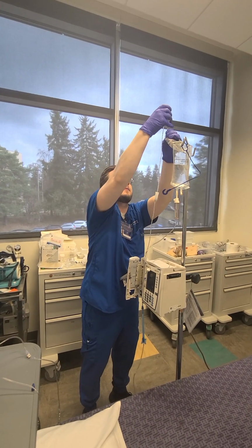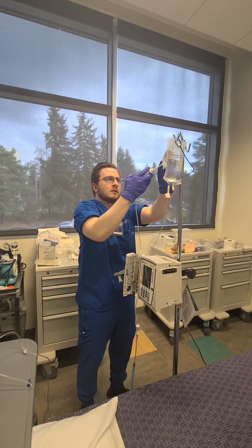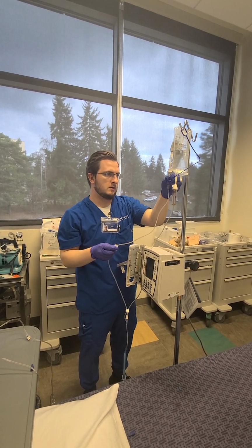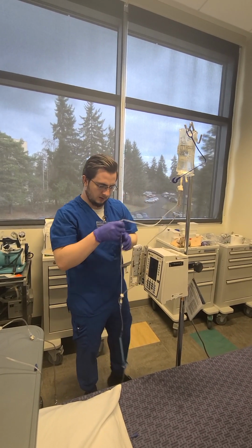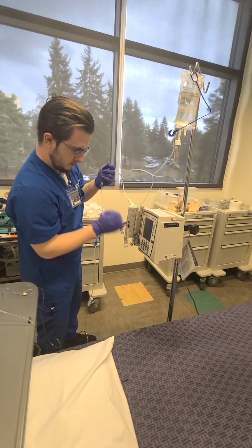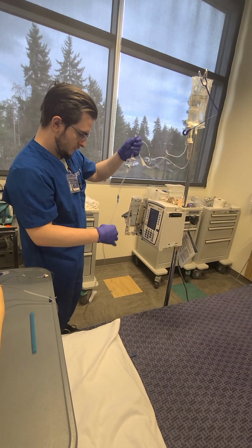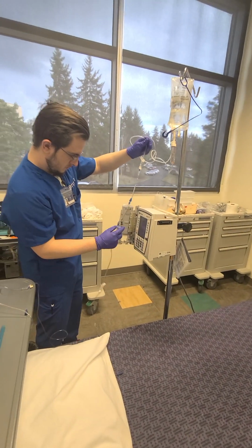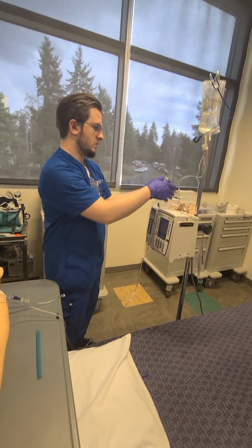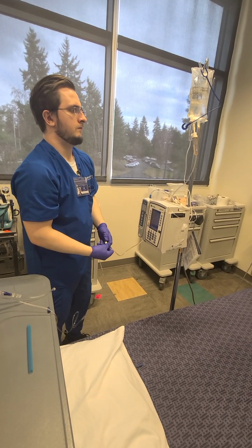It's good. Fill this one up halfway as well, and then I'll back prime it once I get the line in the Alaris. Scan all of the documentation. We've got our Cipro, other saline, and we've got our Zofran. So I'm gonna set up my primary tubing first.